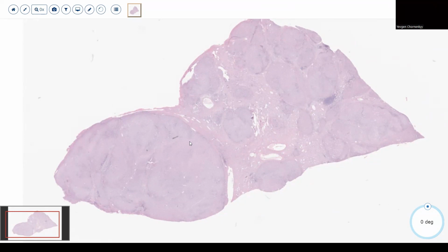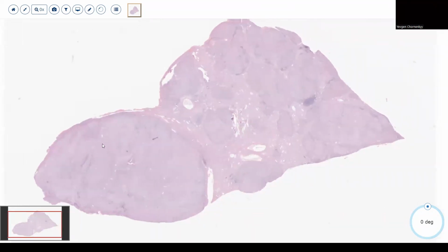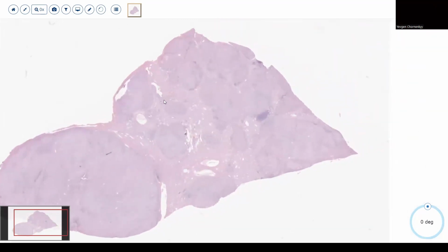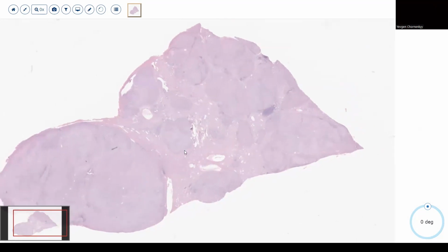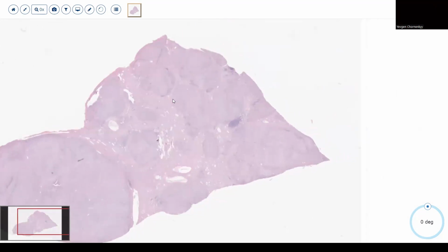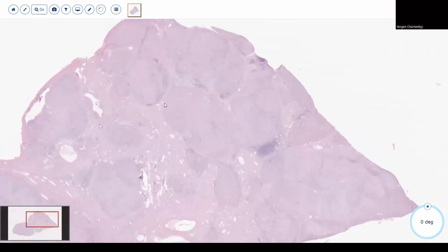Again, I didn't look at them, but it's cool. It's just more like from here it looks pretty nodular. Right, so it's pretty nodular. There's this big nodule here, and some more little nodules here. What are your thoughts? Are you going for malignant? For now, not malignancy. Cool. Okay, I guess I'll zoom in and look around.